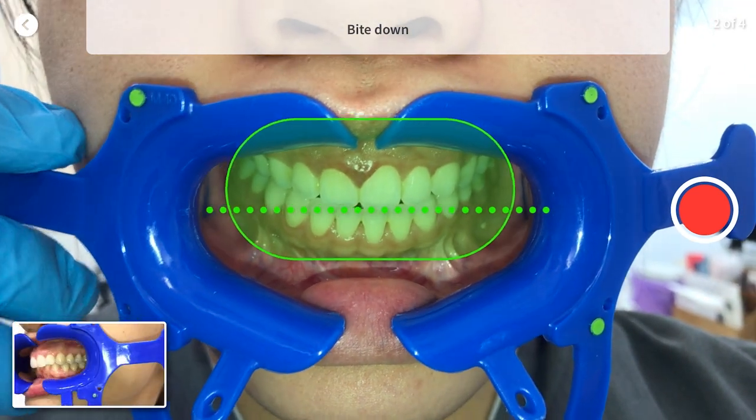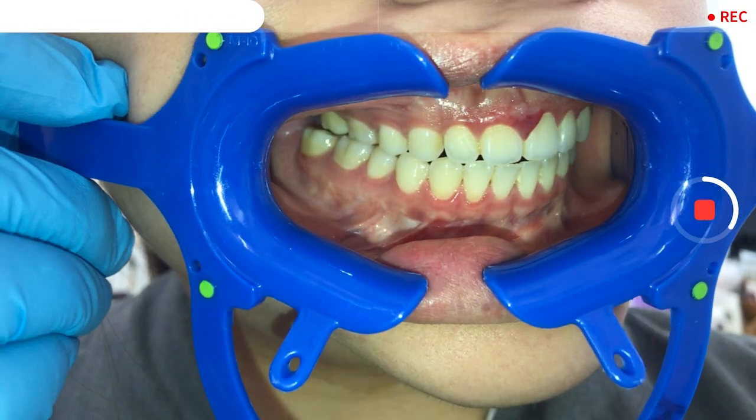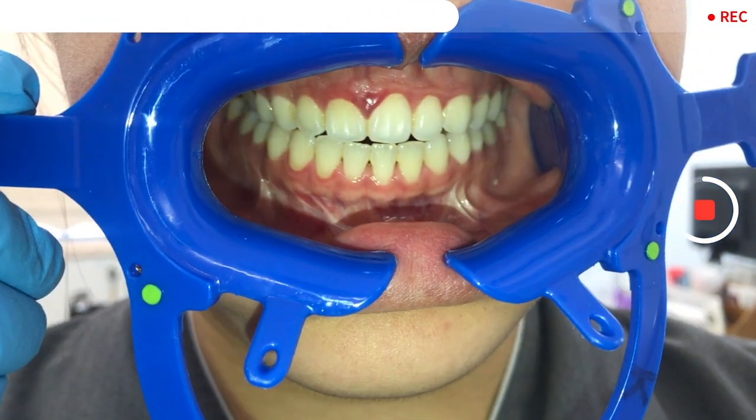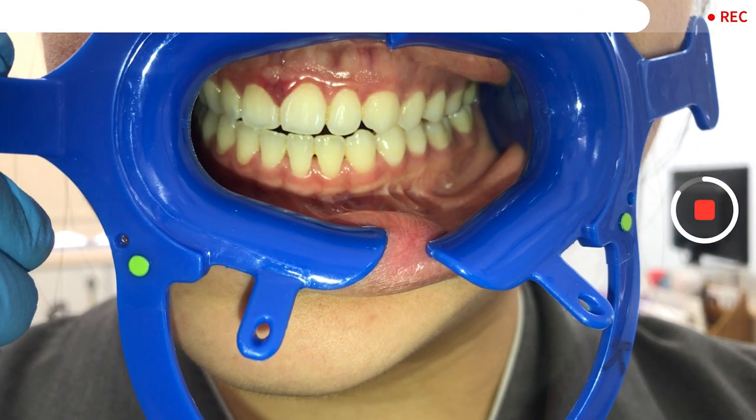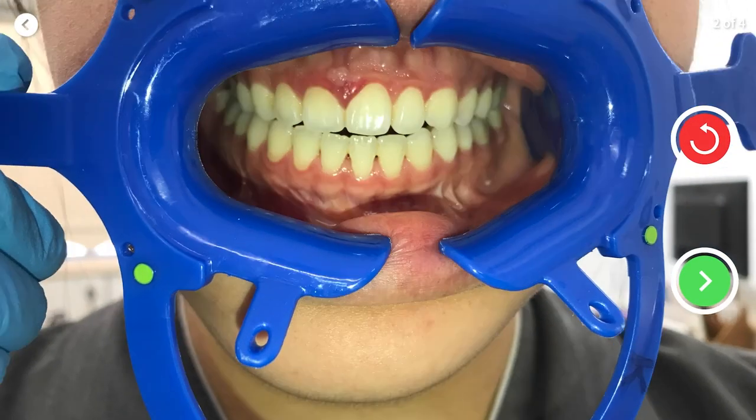Make sure you are biting down on both sides, then align your teeth against the green dotted line. Once ready, click the volume button to take the scan. If you're happy with the scan, press the green tick to take your third scan.